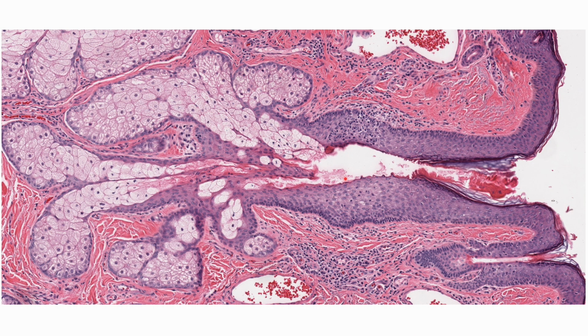This is a hair follicle, but I put it horizontally to have a better demonstration. If you look at the infundibular portion, you can see there is presence of a granular layer. If you go down to the isthmus portion, there is loss of the granular layer. If you look at the duct between the sebaceous duct and the hair follicle, you can see there is a pink cuticle with a shark tooth wavy morphology.